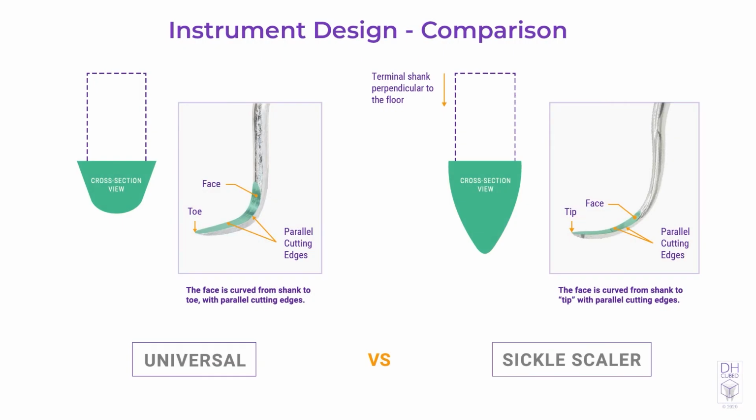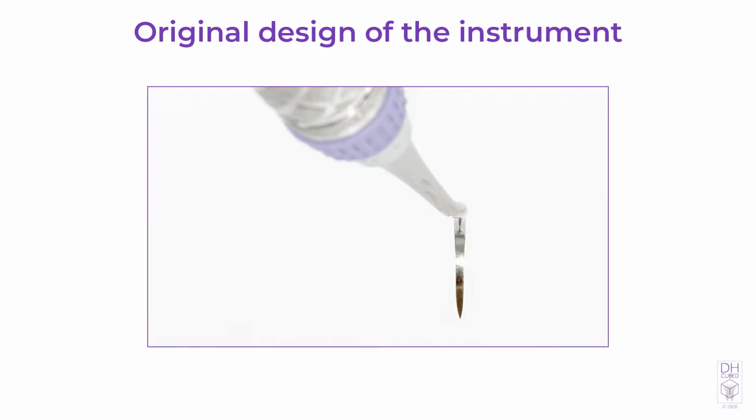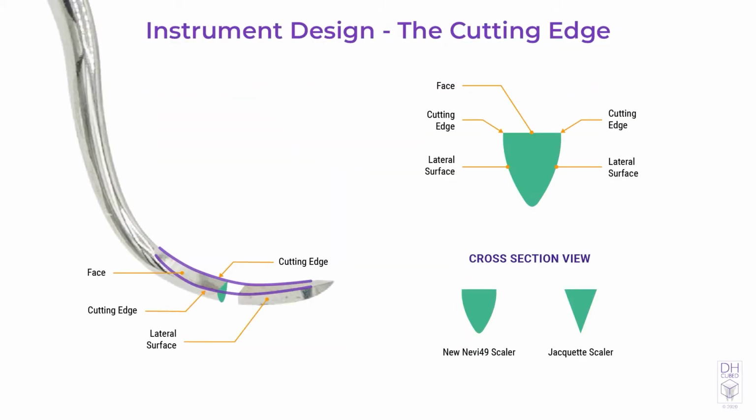The face is curved from shank to tip and is on the same plane, just like the universal curette. Unlike the universal curette, the sickle scaler has lateral surfaces that converge towards the tip, resulting in a pointed end. And in cross-section, the sickle looks like a triangle. Some sickles will have curved sides and some have straight sides. This is important to know because you will better understand the sharpening stone angle and what happens to the shape of the instrument if your angle is off.